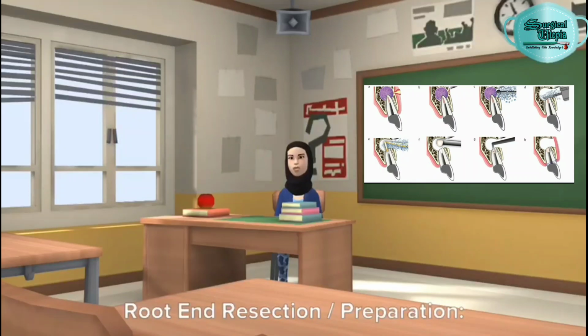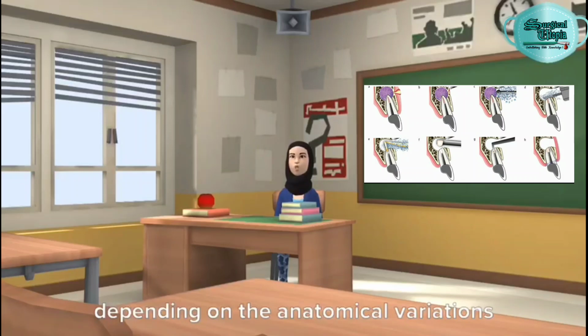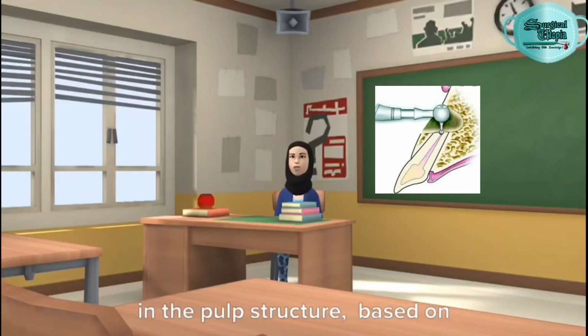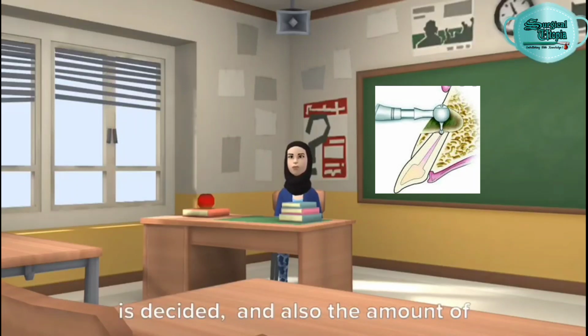Root end resection/preparation. Root resection has to be planned depending on the anatomical variations of the root structure and the pulp chamber as well. There can be many anatomical changes in the pulp structure, based on which the length of root to be removed is decided, and also the amount of bevel which should be given.